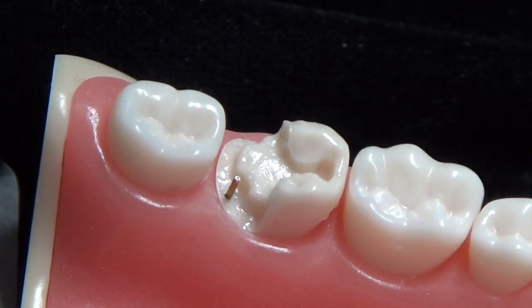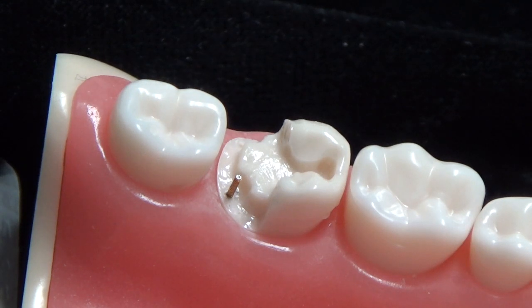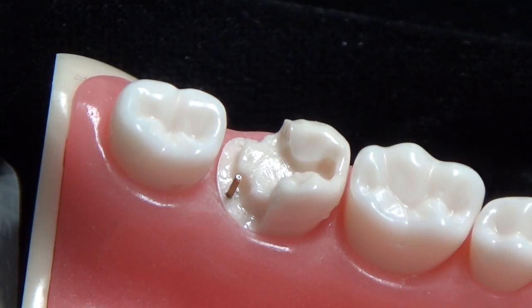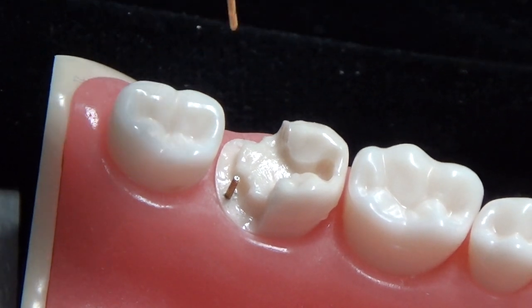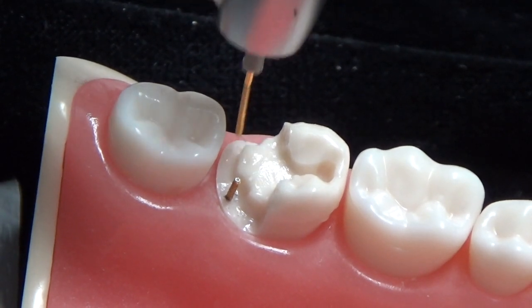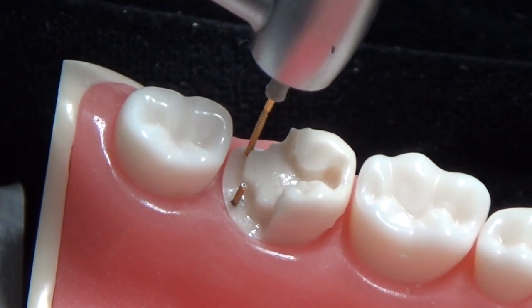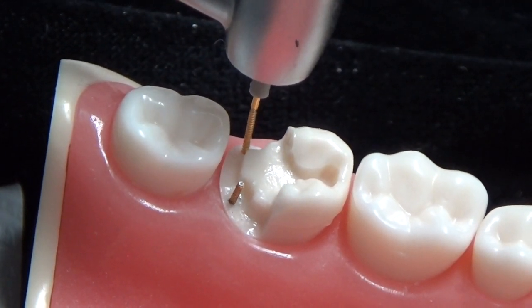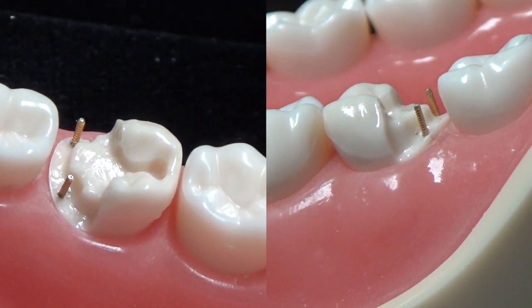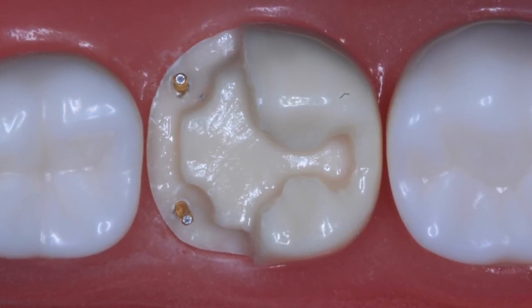For the distal buccal pin, make sure the pin follows the path of draw and that you have the proper speed. Check the path of draw and entry point, make sure the pin follows whatever we prepped before, then press down. At this point both pins are placed, and the next step is to do the restoration.